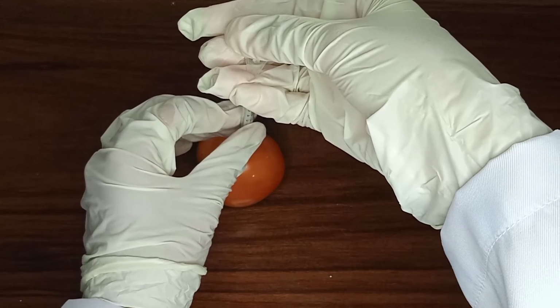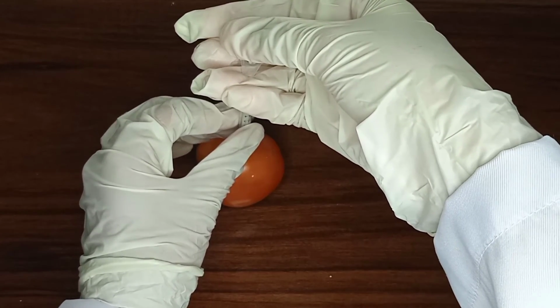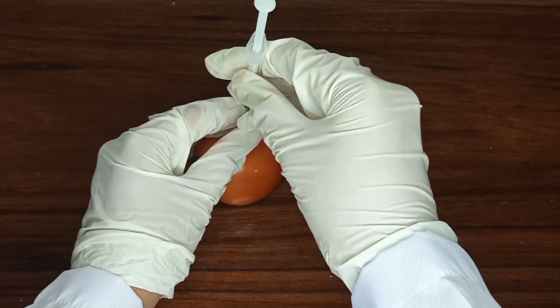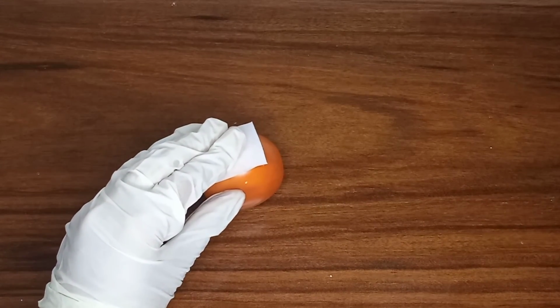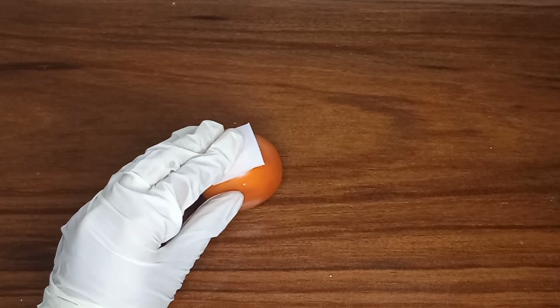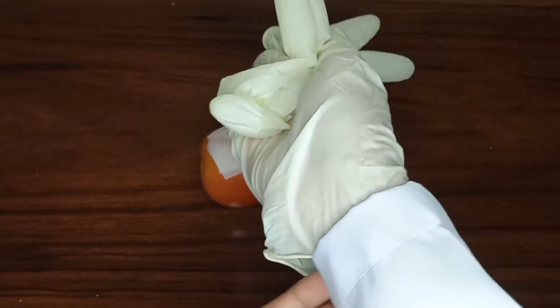Okay. Then we are going to pull back on the plunger to ascertain that the needle is not in a vein. Okay. Pull back. And we are going to quickly withdraw the needle while applying pressure with the antiseptic pad. Okay, so there. And then after, we are going to assist the client to a comfortable position, discard the uncapped needle and syringe in a disposable needle container, and we are going to remove our gloves and wash our hands. And lastly, we are going to document all relevant information of the client.